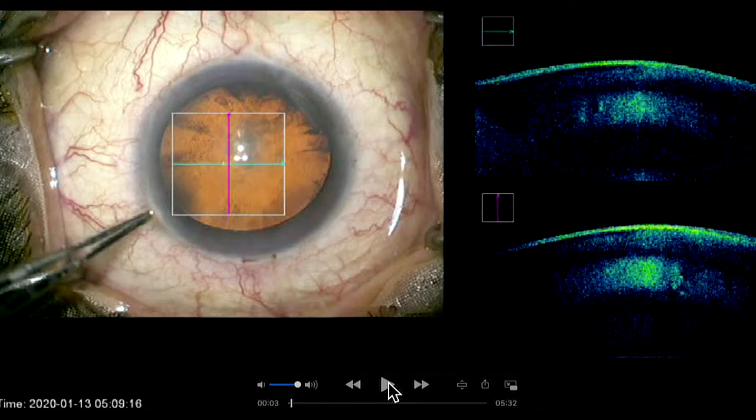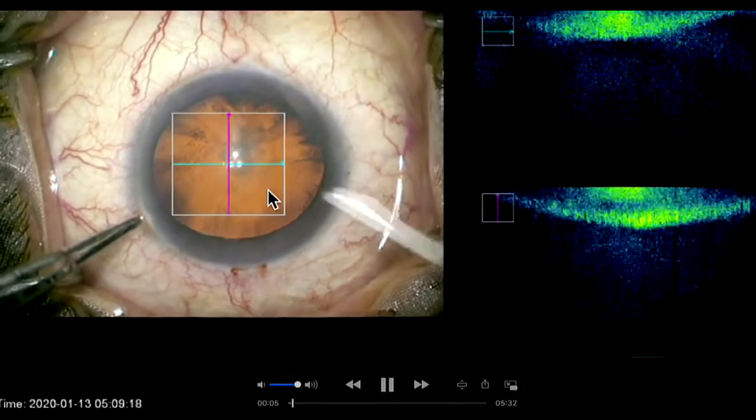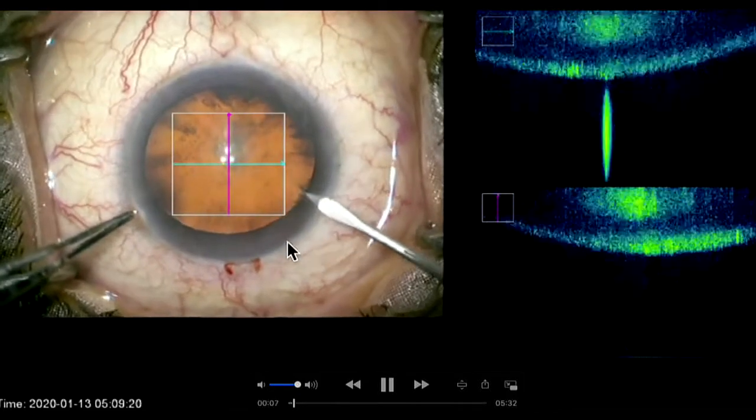Then look for examination of the nucleus — its hardness. The status of anterior and posterior capsules should be assessed, apart from the corneal endothelium status in these patients. You can see that good dilatation is a prerequisite for all these patients.